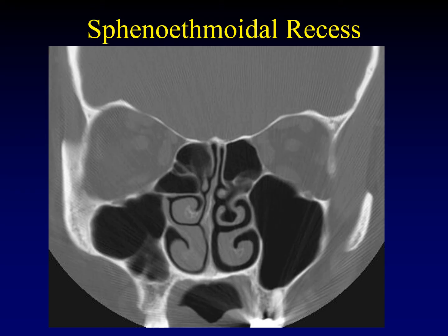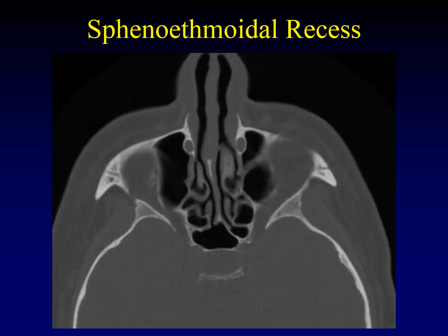The sphenoethmoidal recesses are more posterior. Here you can see the sphenoid sinus draining through the sphenoethmoidal recess, ending up in the superior meatus, with a couple of posterior ethmoid air cells joining in — same on the other side. Most anatomy in the nasal cavity is best seen in the coronal plane, but the sphenoethmoidal recess is perhaps better analyzed on axial images. On axial images you can clearly see the sphenoid sinus, its os, and the sphenoethmoidal recess with posterior ethmoid air cells joining in. If you're having trouble finding this structure on coronal images, axial images will come through for you.